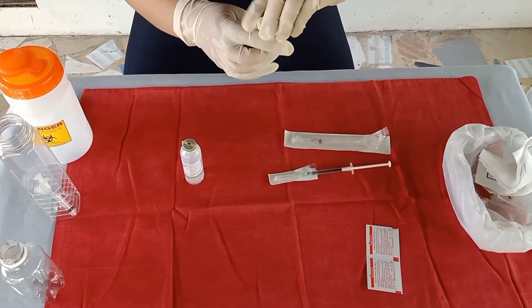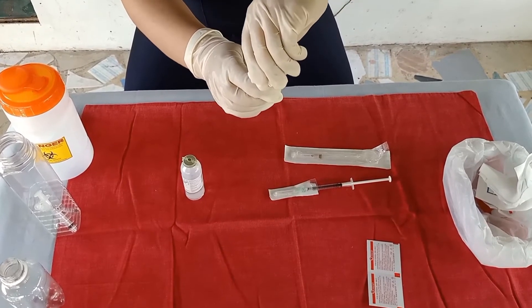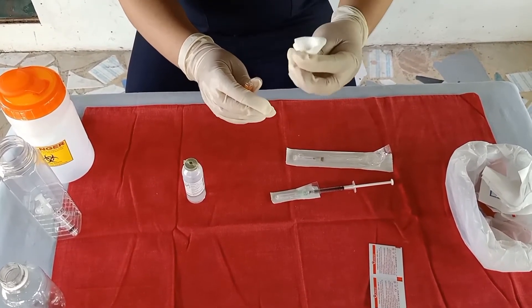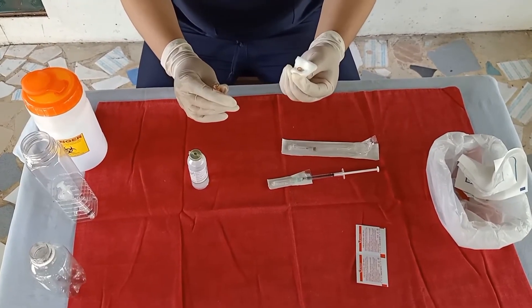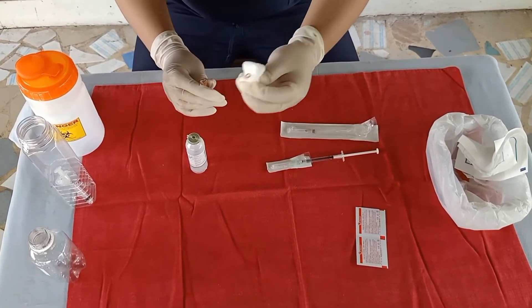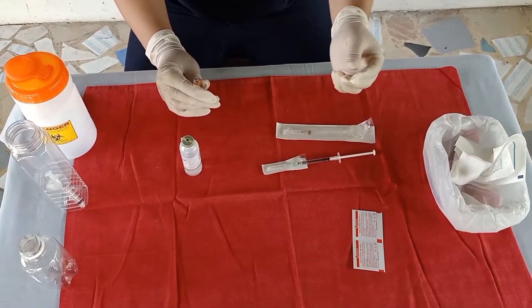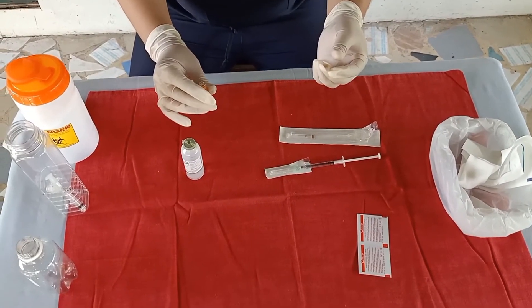Place a piece of sterile gauze between your fingers. Dispose the top of the ampule in the container for disposal. Place the ampule on a flat surface.